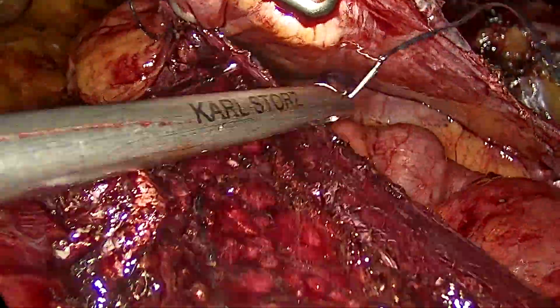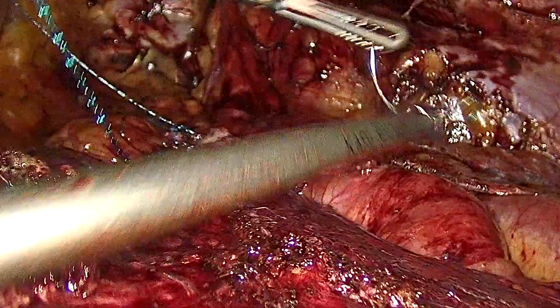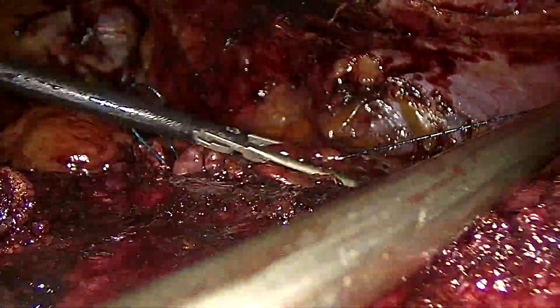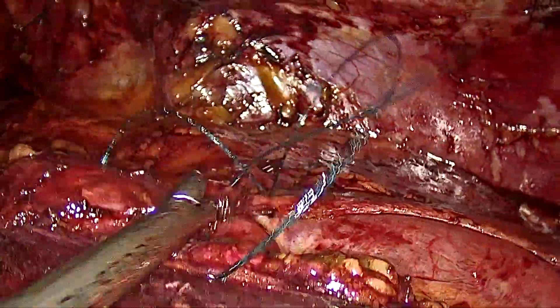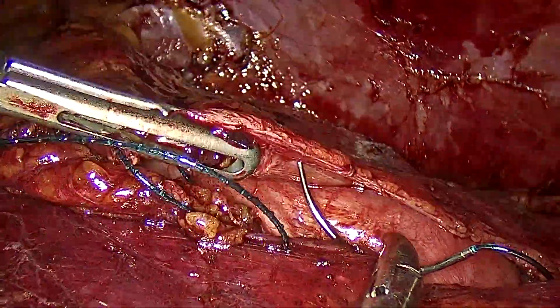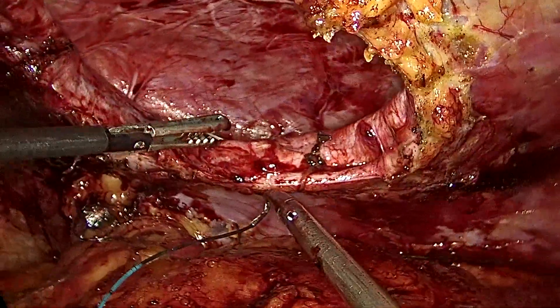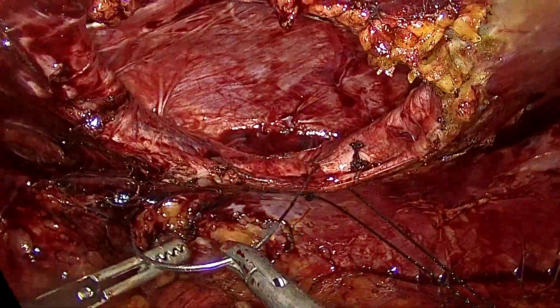The peritoneum is closed with absorbable 3-0 barbed sutures, placed in a continuous fashion and oriented to minimize suture line tension. The hernia defect is closed transversely using 2-0 absorbable barbed sutures in a continuous fashion.